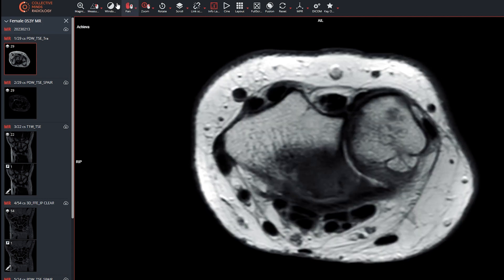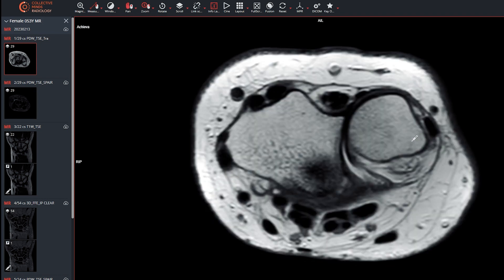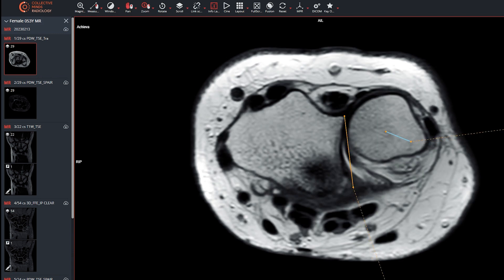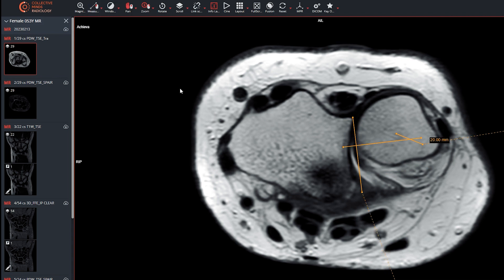Let's go back to our initial case where there seems to be a dorsal subluxation. Applying the correct method: find the center of the head and the center of the ulna, identify the midpoint of that connecting line, then identify the sigmoid notch edges. Draw a line perpendicular to the sigmoid notch line through that center point at 90 degrees, then subdivide into quadrants. In a normal situation this falls within the central 50%. In this case it's roughly about 50%, so this would not count as unstable — though there is quite large overlap in the literature.